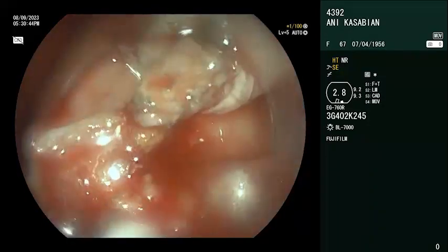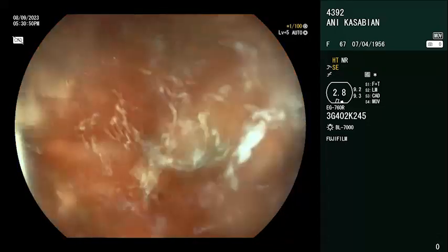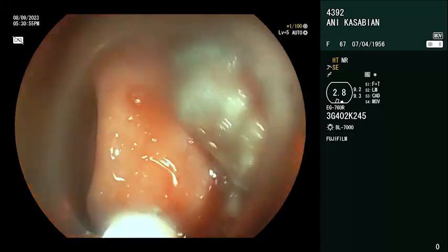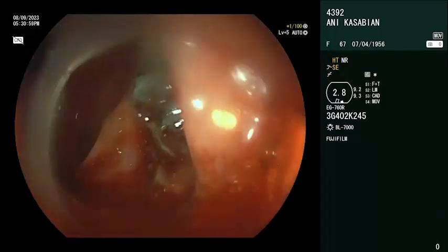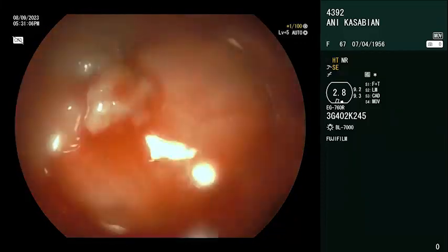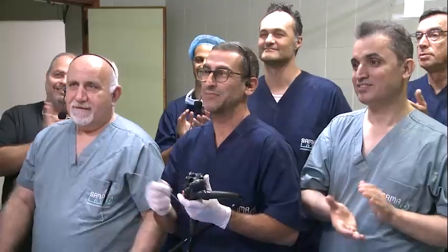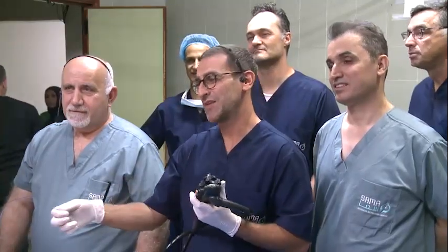Almost. This bridge. Of course, I have vessels. But okay, then we will take some time. I think it's almost separated. Separated. Okay, it's done. Excellent. Okay. Thank you.